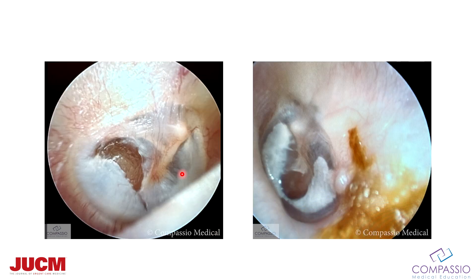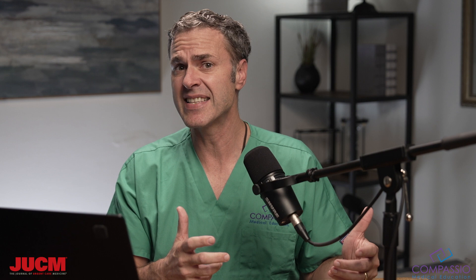This is more extensive myringosclerosis — a right ear. Look at all of this scarring right here. It may even give the illusion that this is a perforation, but it's not. This is a horseshoe of myringosclerosis that may give the illusion there's a hole, but there isn't. You don't have to refer these patients to the ENT provider unless they're complaining of hearing loss.